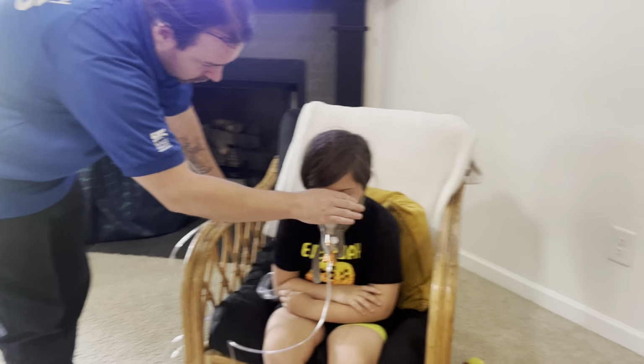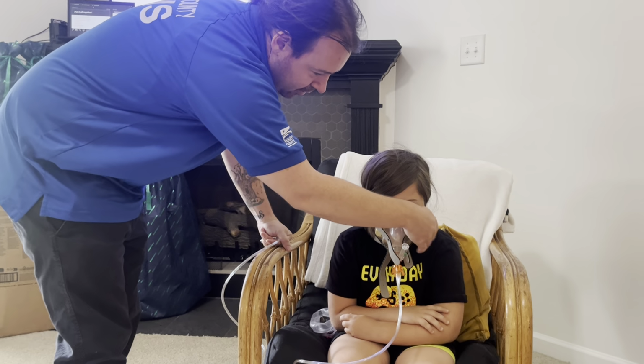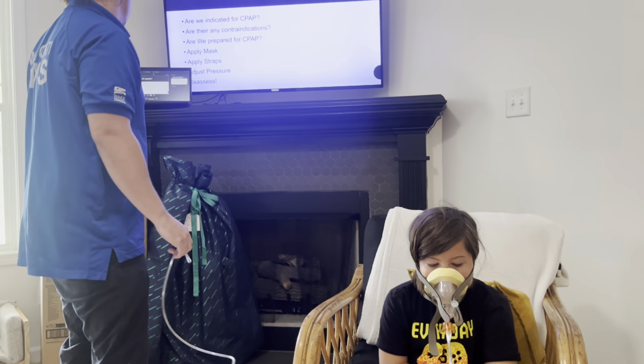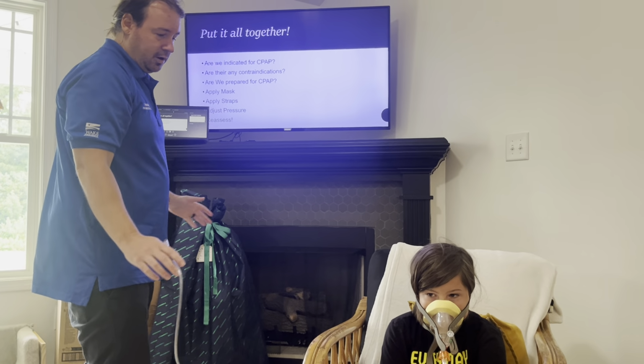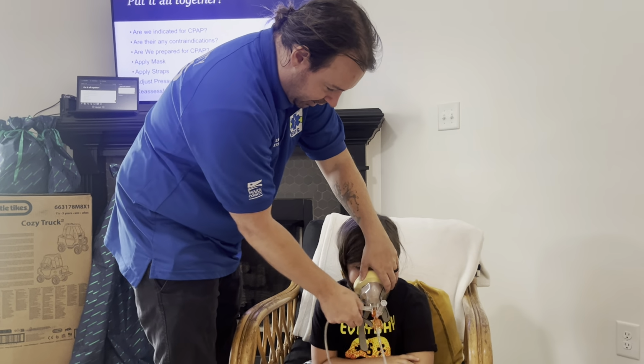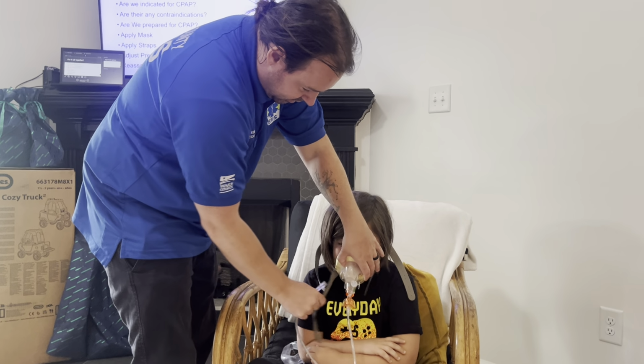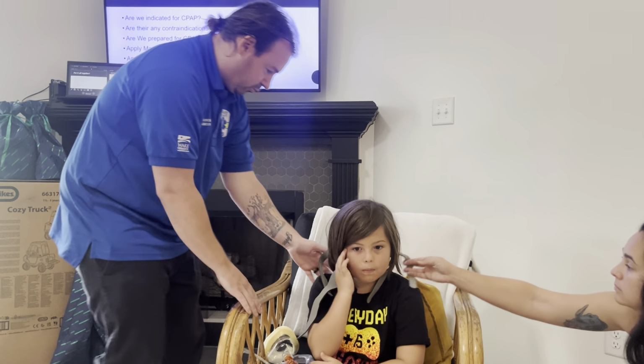Now that we've set our pressure, we reassess, make sure that there's no leaks in the seal. Now that we've reassessed the pressure, there's no leaks in the seal, everything looks good, we are all done. We continue to monitor and reassess the patient, right? Look for the trends and the vital signs. Now, hang tight for just 1 second there, buddy.